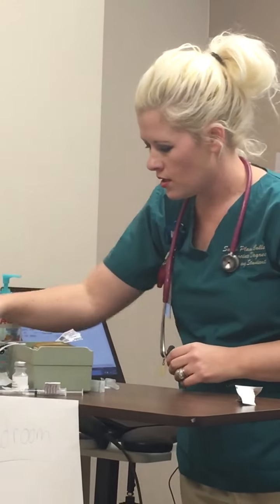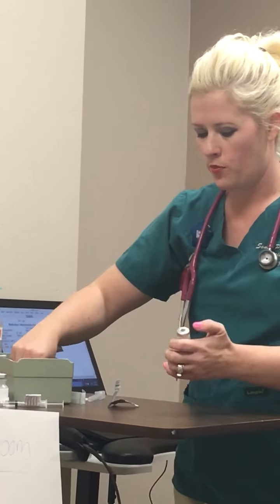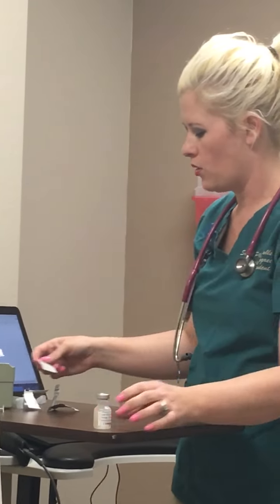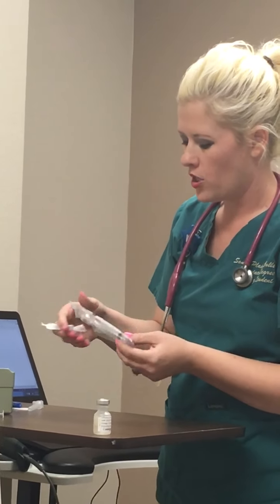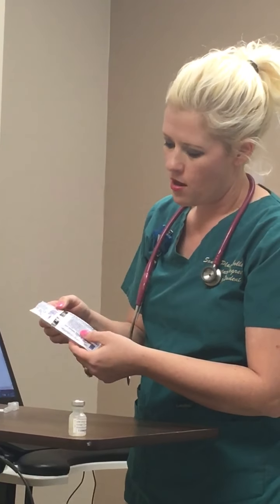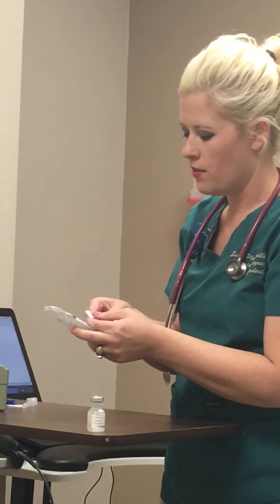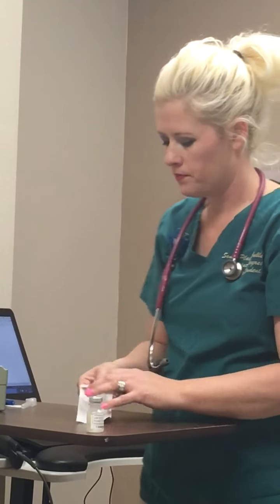My next medication I'm going to pull up is an IM injection. It's influenza. I'm going to go ahead and pop my top, clean my vial, and put it in the corner so I don't knock it over. I'm going to get out my packaging, making sure I'm checking my expiration date, making sure it's intact and it is the correct size. This is a 22 gauge needle attached here. It's a 3 ml syringe, and I'm going to be administering this IM, so I know I can go with a 1 inch or 1.5 inch. My packaging is all intact and my expirations are good.